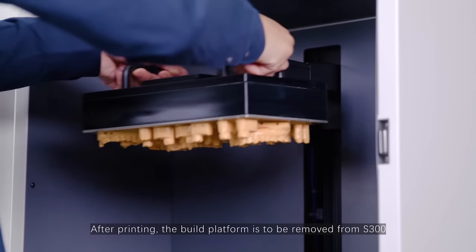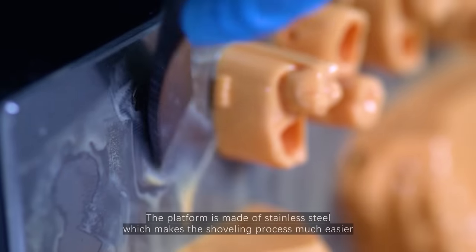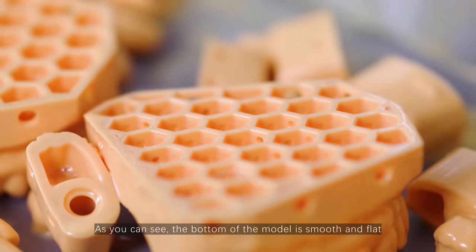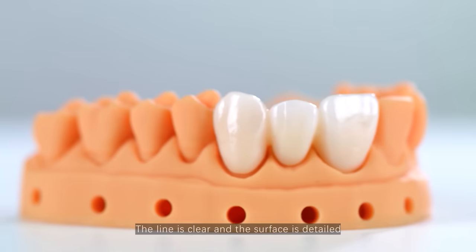After printing, the build platform is to be removed from S300. The platform is made of stainless steel, which makes the shoveling process much easier. As you can see, the bottom of the model is smooth and flat. The line is clear and the surface is detailed.